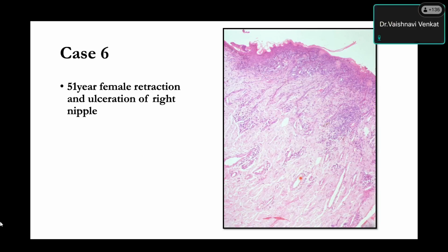Yes, please. It is located in the epidermis, ma'am. Okay. And what other changes do you see at this power in the epidermis, other than the pathology? We'll come to the pathology in the epidermis. So what other changes can you see? There is hyperkeratosis, and there is some amount of increase in the thickness. So there is acanthosis. Right.